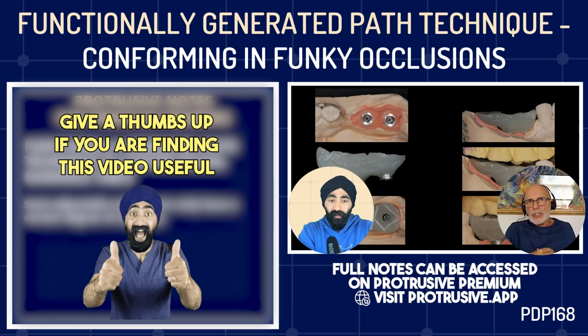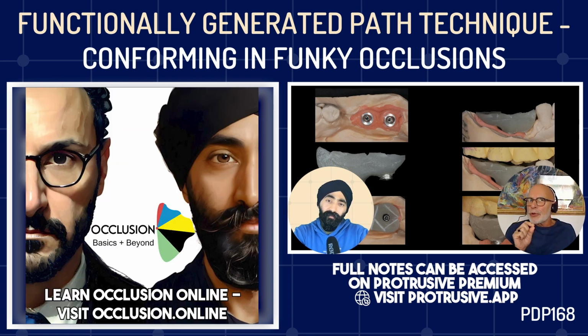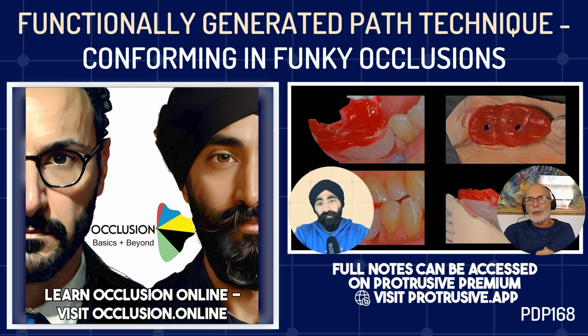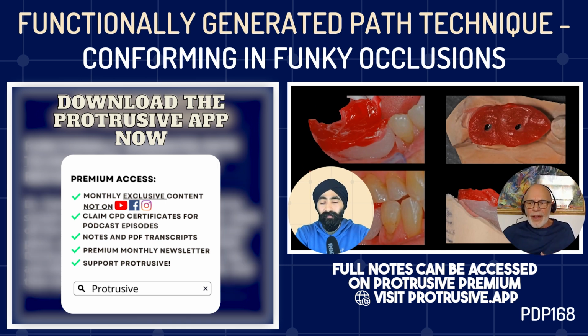The other thing that you mentioned, is there anything else that I'd want to say? I'd want to say is we've talked about one unit. Let's say that we've now got the lower right 5, 6, 7, 8 missing, and you've placed 2 implants. Well, of course, you can't do your technique of using some old composite because there's nothing to put it on. It's fresh air. And so that's where I have a little jig made up, which I screw into place.